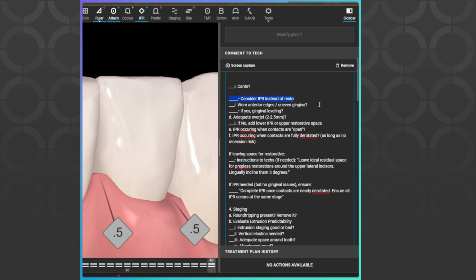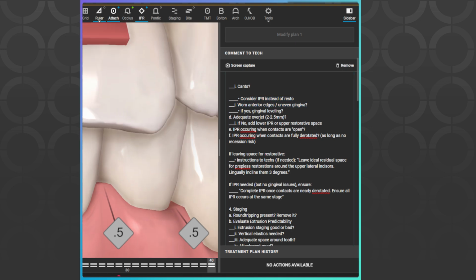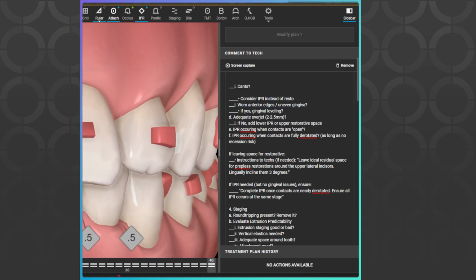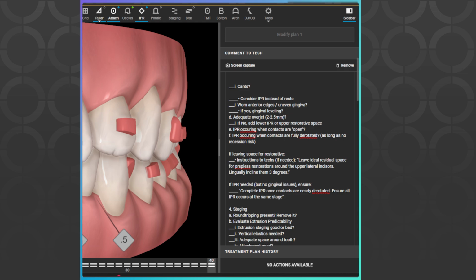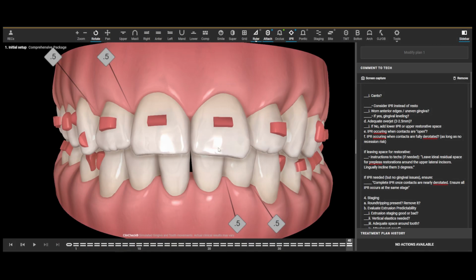Okay, next thing is going to be anterior worn teeth, uneven gingiva. So as we look at the teeth, do we want to level the gingival margins or the incisal margins? I mean, she does have some wear in this case, but in her particular case, I can tell you in advance here, we did not actually do any restorative, but you could consider it. There is wear, and the width of the teeth and the length of the teeth is starting to get out of sync because of that grinding. But it's just the consideration of, do you level the gingiva or not?